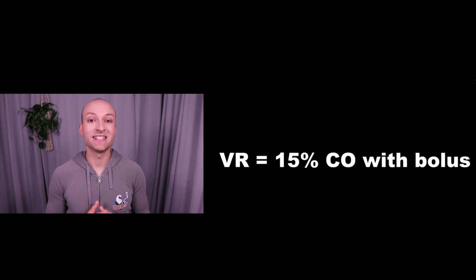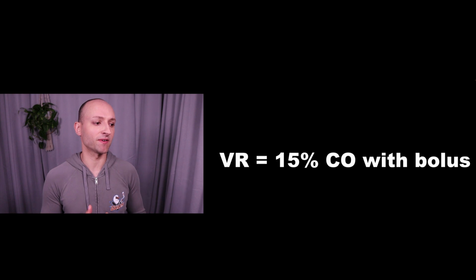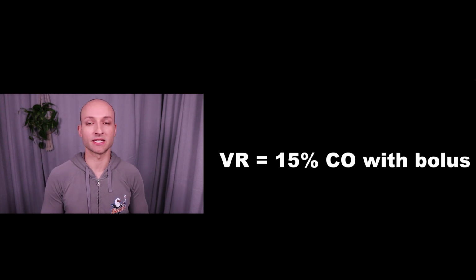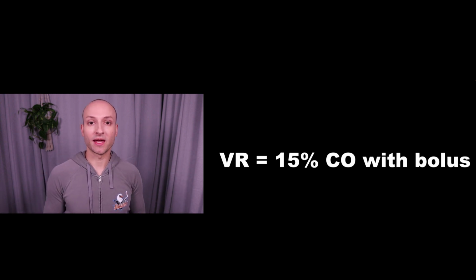Let's start off with the definition of volume responsiveness. So volume responsiveness is defined as a 15% increase of the cardiac output with a bolus. And that can happen with an actual bolus. That can happen with a passive leg raise, which is an interesting thing.